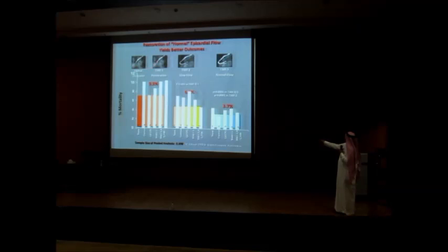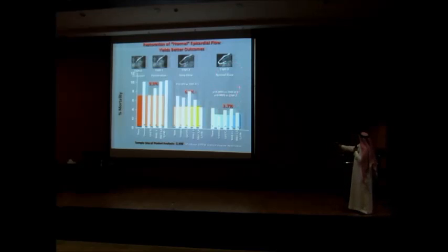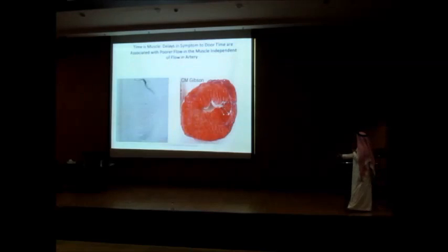There is no blood flow. Here there is slight penetration. Here there is distal opacification of sluggish flow. This is normal. So if the patient presents with TIMI 1 and TIMI 0, their mortality is almost 9%. So if you open the artery and achieve normal flow, the mortality goes down from 9 to almost 4%.